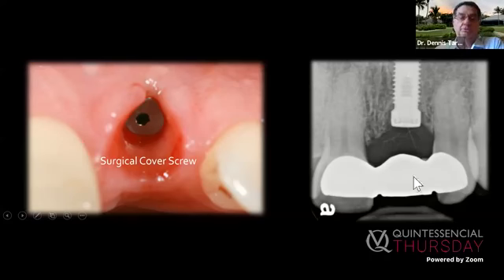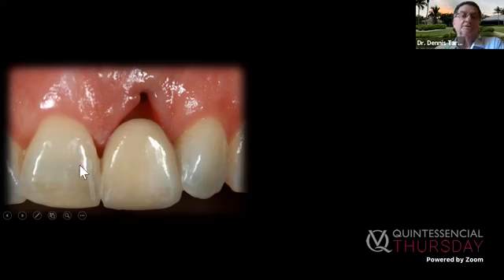We did a bonded bridge, so the patient immediately had it out of occlusion, just bonded and spot etched to the adjacent teeth. You'll see that a lot in these cases. We put the cover screw on. There's the bonded bridge that was made with just some spot etching and leaving the space. Don't put a Pontic in there. Leave a space there so that the tissue can grow in. So I had the patient come back in 2 weeks. Steve put this on, and I had the patient come back in 2 weeks for me to do the surgery.